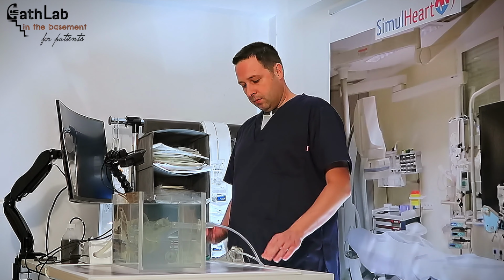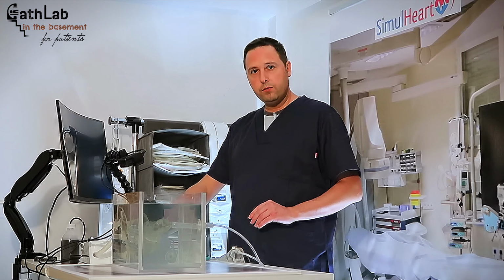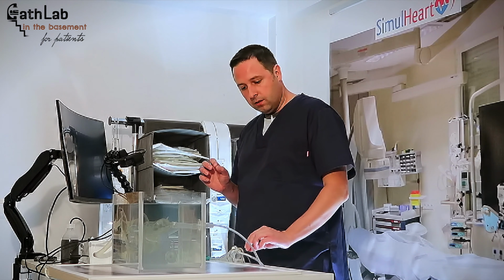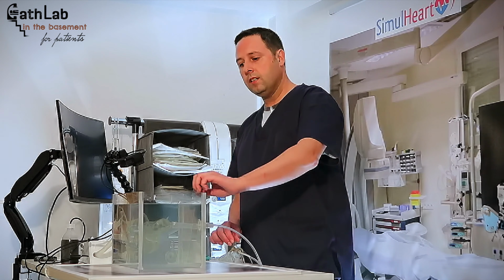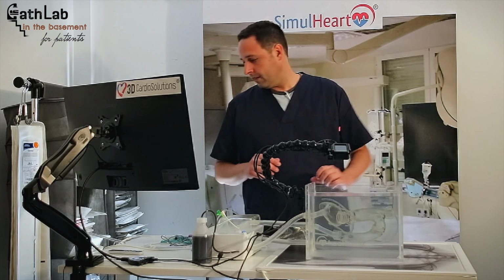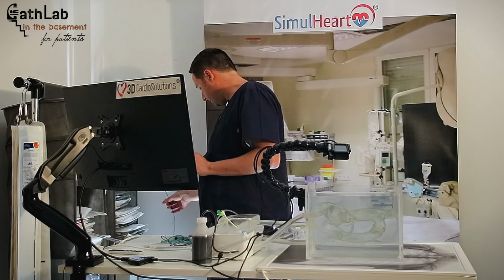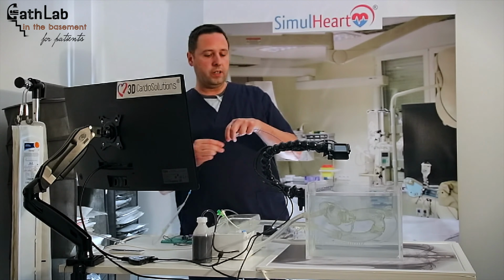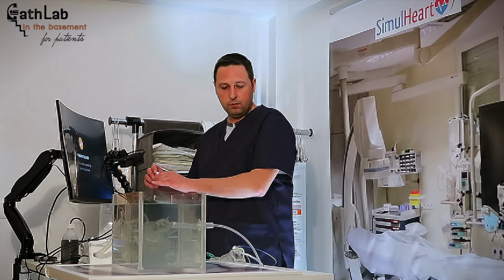The next step is, when we have inserted the sheath, that can be in the radial artery or the femoral artery, we have to use a catheter to go along the arteries in the arm and to get to your thorax, to your chest. So let me show you how we can do that. You have to place a wire inside the catheter, and then take the wire.